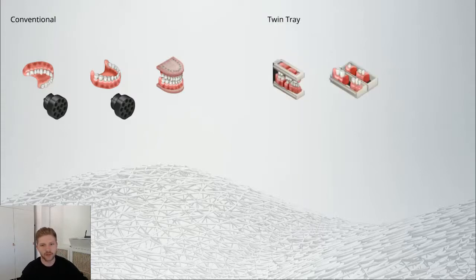But we also have the Twin Tray way. Basically, there you only have to perform two scan steps. You first start with the vestibular scan, and afterwards you do the segmentation all in one, so to say. For this we use these little Twin Tray models, and you also need the all-in-one plate you have right there, and in addition we have our little four-teeth bar to realize the scanning process.